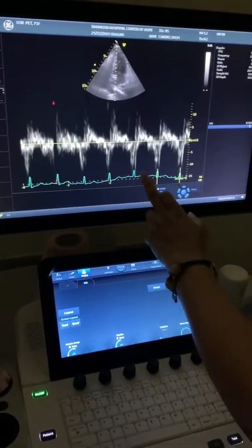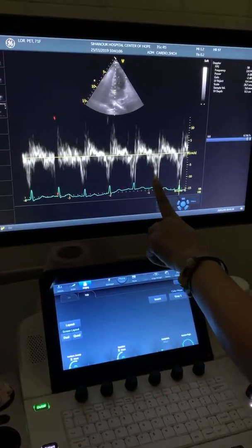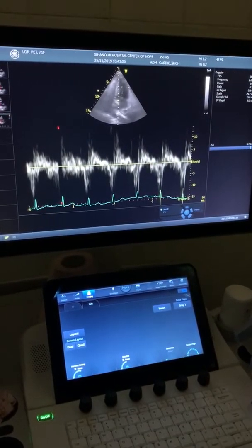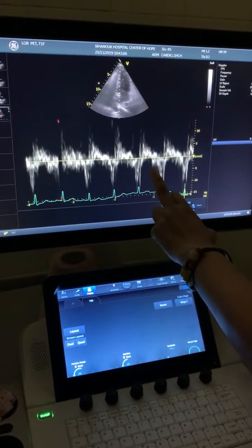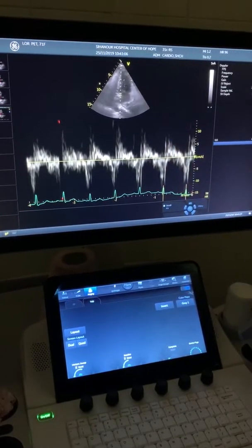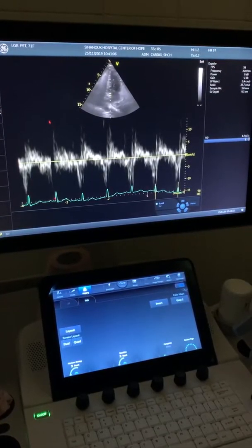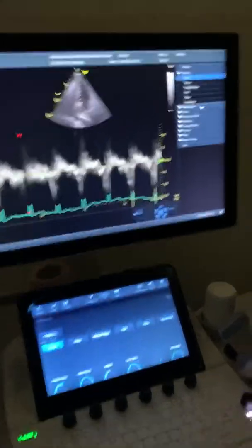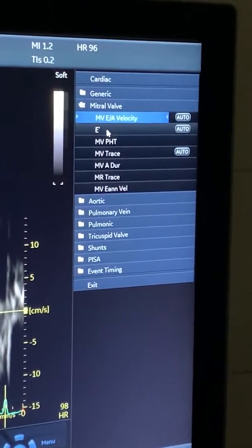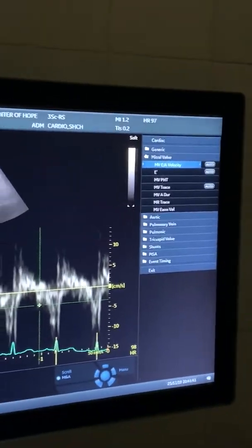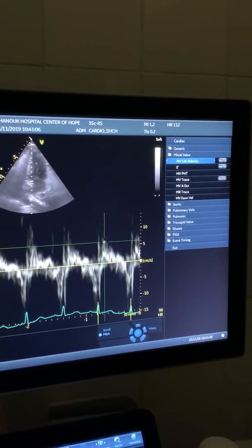This one you need to see also because now it's reversed. Unlike in mitral inflow where you cannot see them because they're fused, TVI shows you good - you can see your E and A. This is your systolic. So this is going to tell you your E, A, and your systolic. That's what you do your measurement.